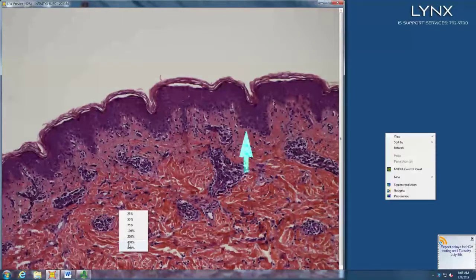It didn't strike me as PLEVA. I thought it would have a lot more features. So PLEVA tends to have a crust and lots of red cell extravasation, but what kind of pityriasis lichenoides is not PLEVA? PLC. Okay. So pityriasis lichenoides chronica.